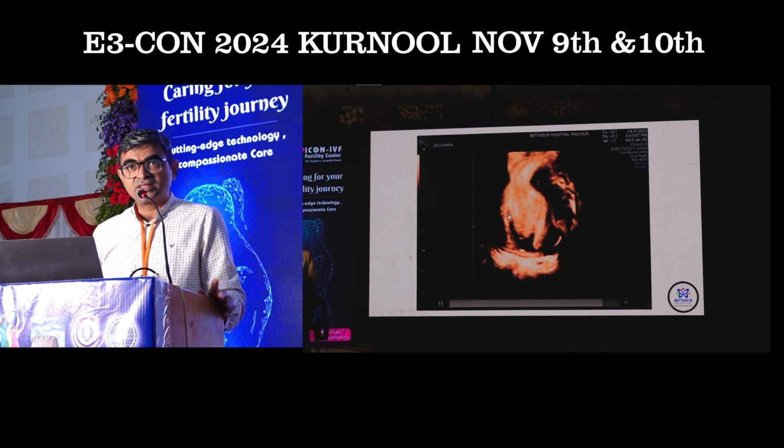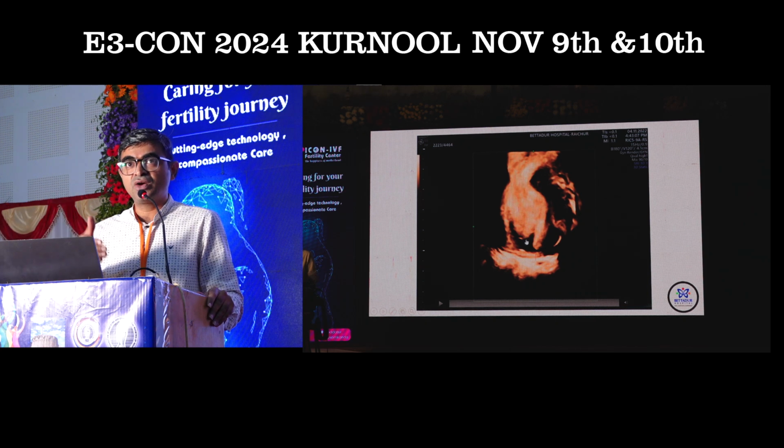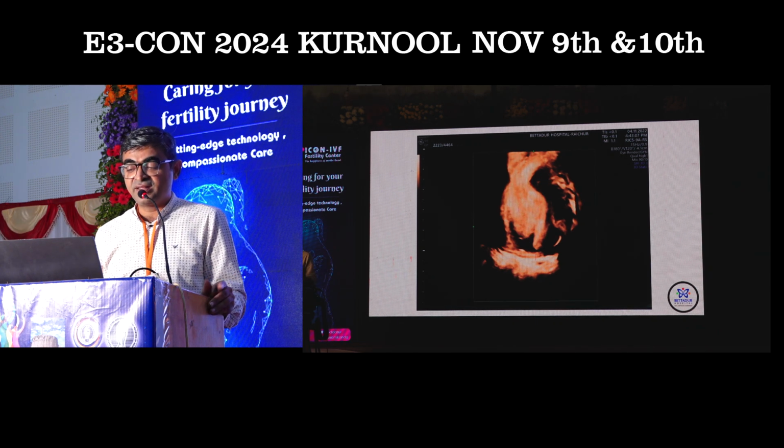So, sometimes for a complete septate, a didelphys or a bicornate uterus, it's not always necessary that you should get the whole coronal plane in one go. You have to take the upper corpus separately, because it is for us to diagnose it. So you have to take a cervical 3D also separately.